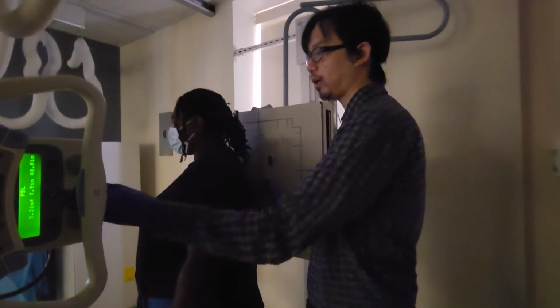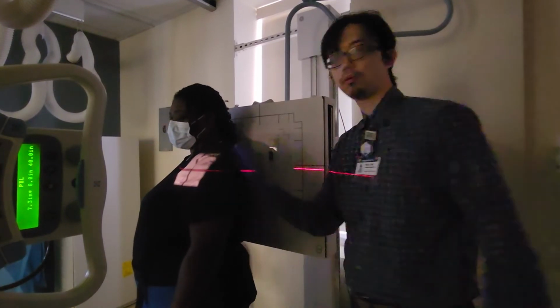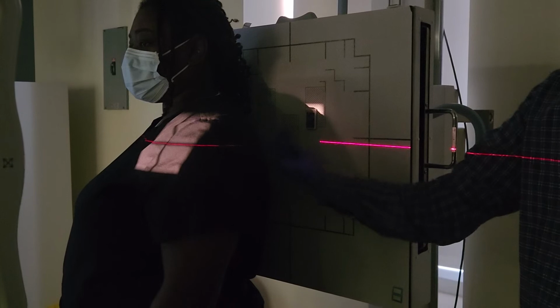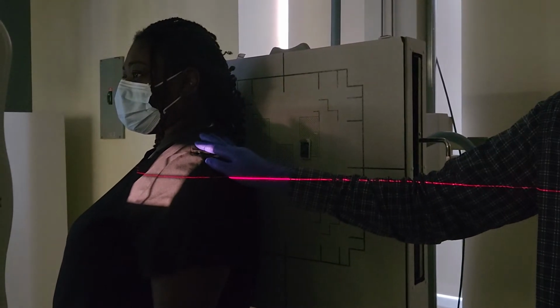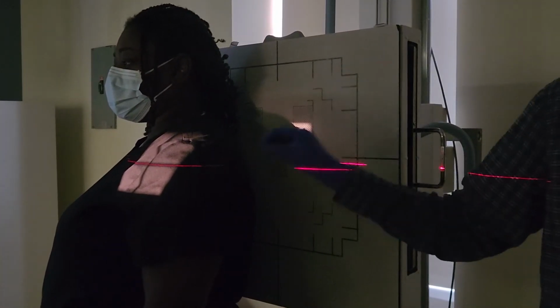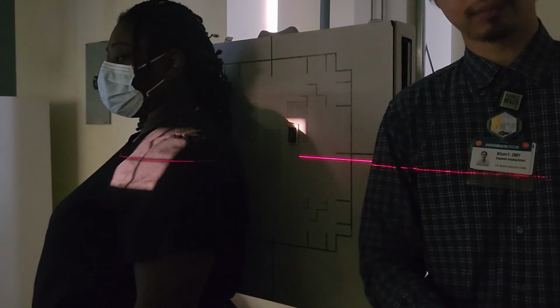All right, and so I would be shooting at this shoulder right here. What do you notice? The OID. There is a lot of OID here, right? So yes, this is going to be faster, this is going to be more convenient for the patient, but there's going to be a lot of OID. So you will see this in clinic. They will do their Y views AP.